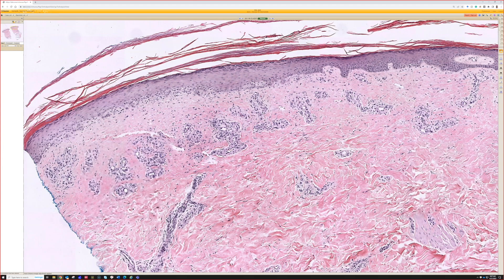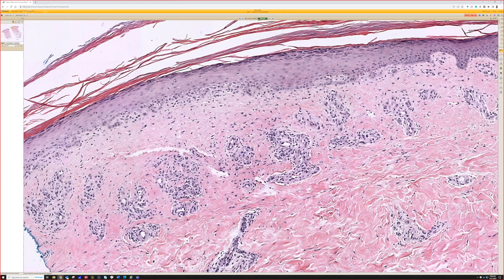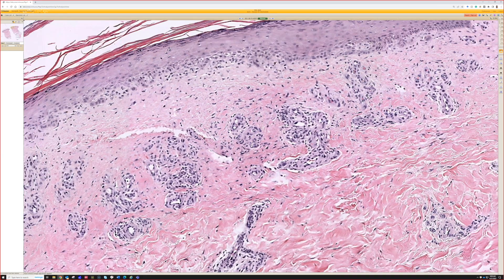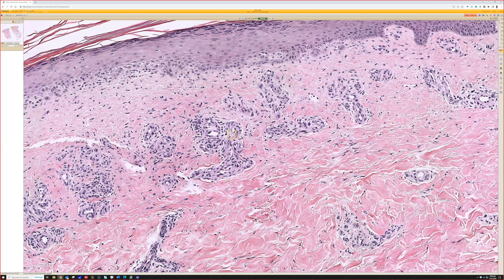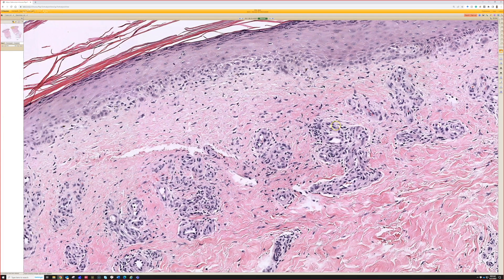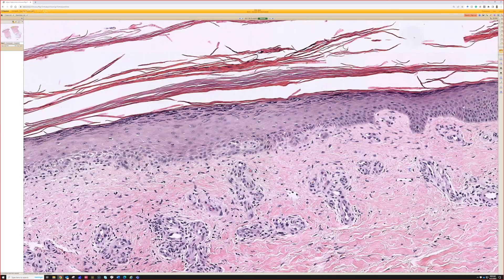Context clues in the histology would point to a vascular proliferation as most likely, and I think that checks out — small little aggregations of vessels, maybe a little bit of homogenization of the superficial collagen, a little bit of compact scale.